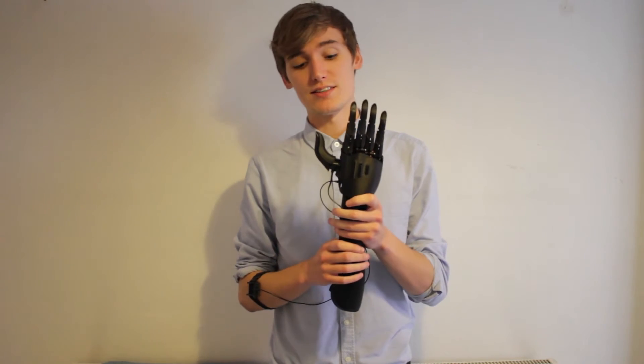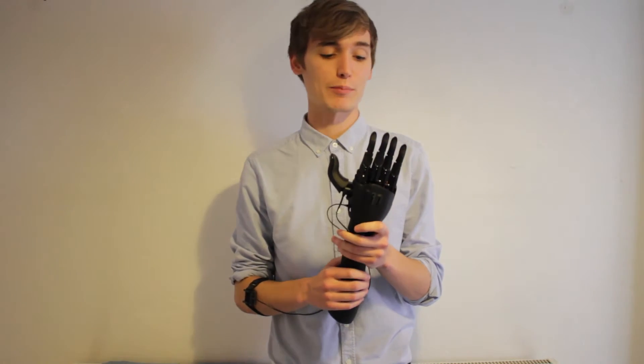Ryan recently sent us some footage of his hand now that he's out of hospital, which is great. But as you can see, he's got quite a lot of his palm left. So we found a way of modifying the Hackberry so it's going to fit him.